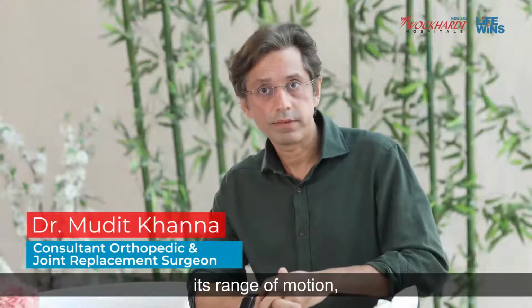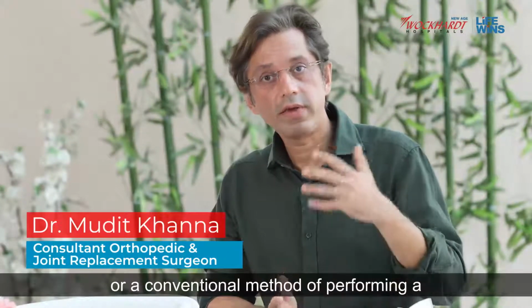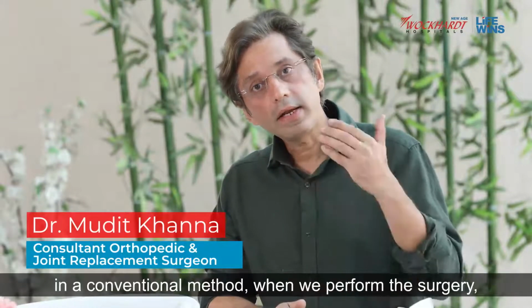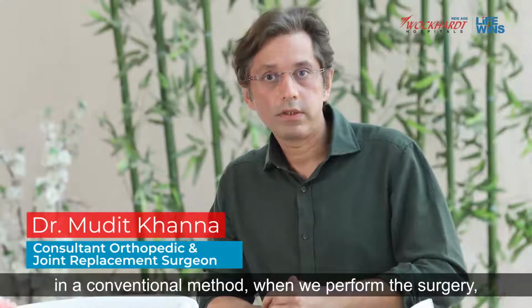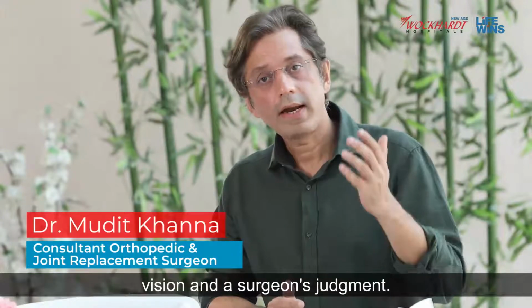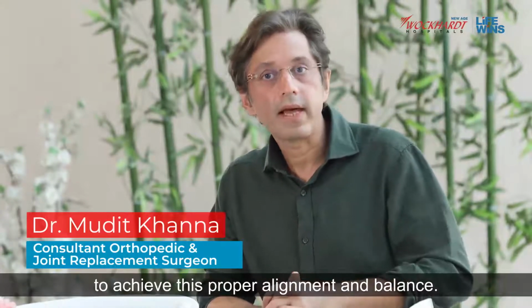Coming back to the traditional or conventional method of performing a knee replacement surgery, we primarily rely on the surgeon's vision and judgment to achieve proper alignment and balance.